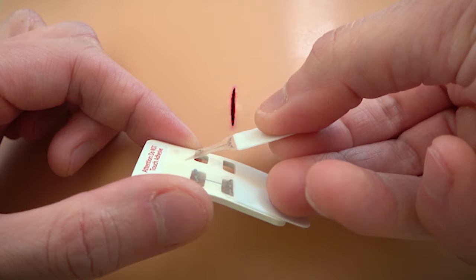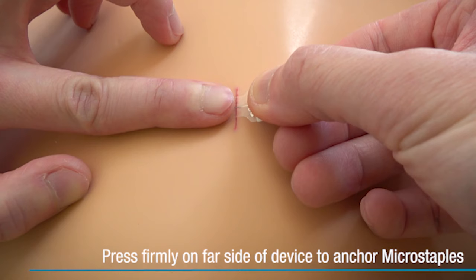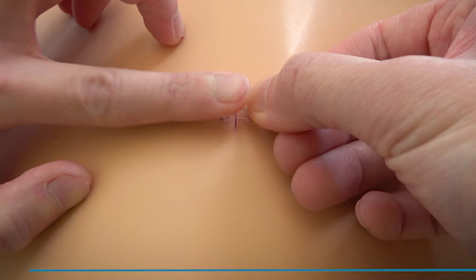Make sure the skin is completely dry before applying Micromend. Remove one of the Micromend devices. Press firmly over the far side of the device to anchor the microstaples to the skin, and then bring the wound edges together using the tab.